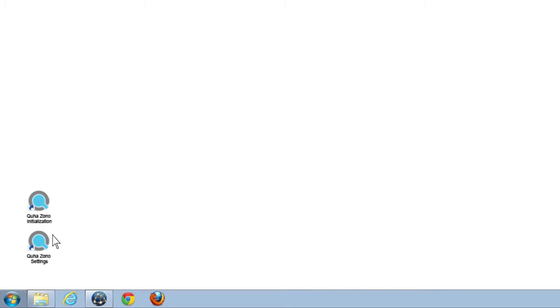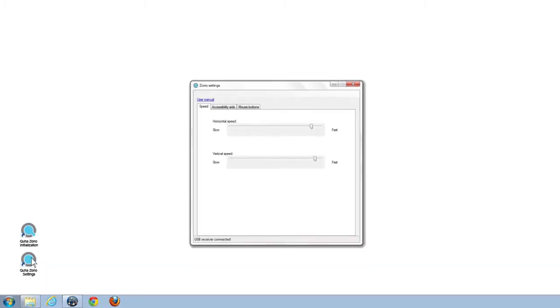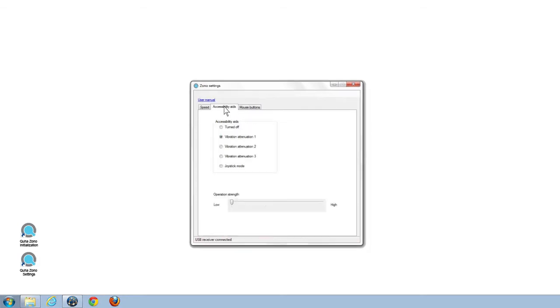The two other tabs in GUHA ZONO settings labeled speed and accessibility aids are for changing the horizontal and vertical speed of ZONO, and a collection of different aid functions that can make ZONO usage even easier. Each function changes ZONO's behavior differently, and you should just try them out to find the best combination that suits you.